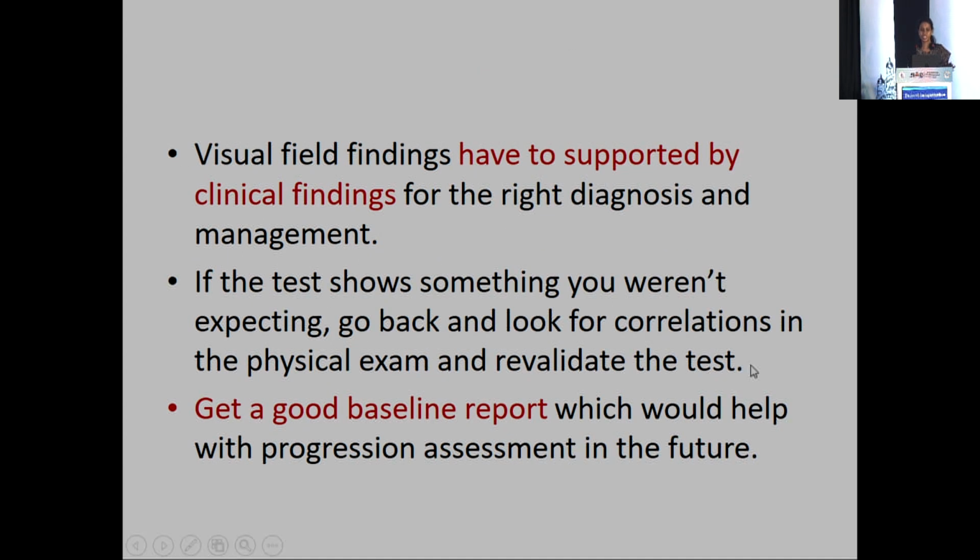So visual field findings have to be supported by clinical findings. If the test shows something you are not expecting, go back and look at your clinical findings again and then revalidate the test. Getting a good baseline report is important not only for diagnosis and management, but also for future monitoring.